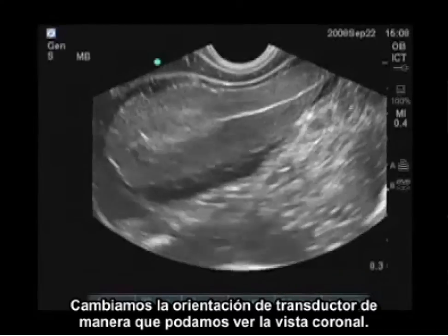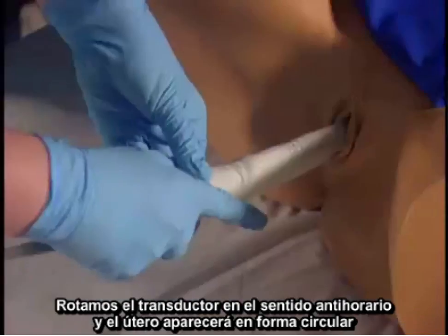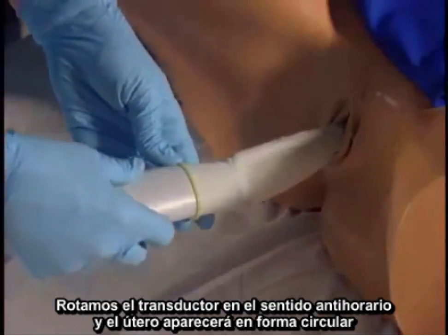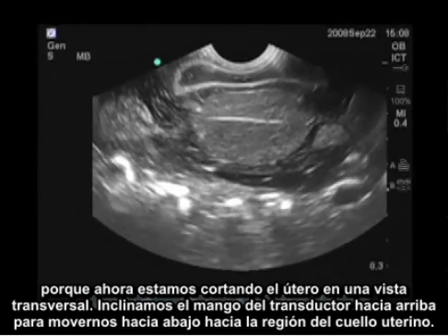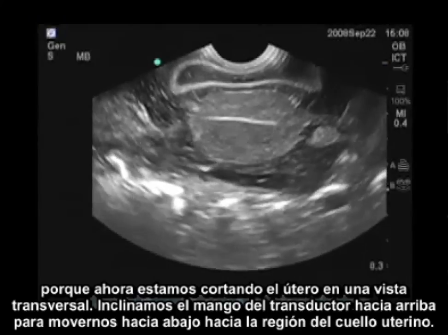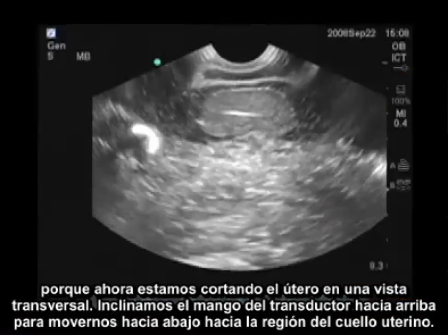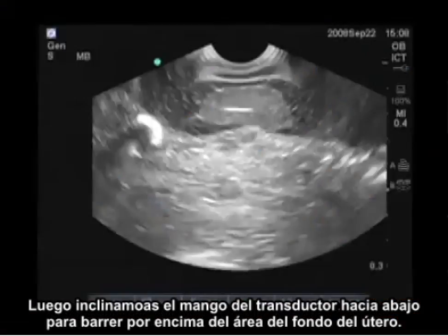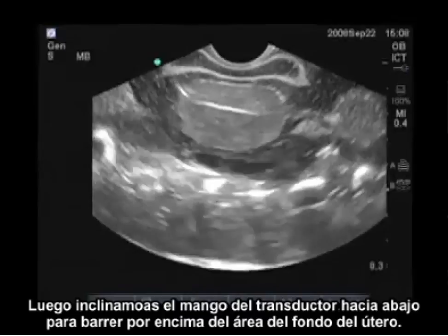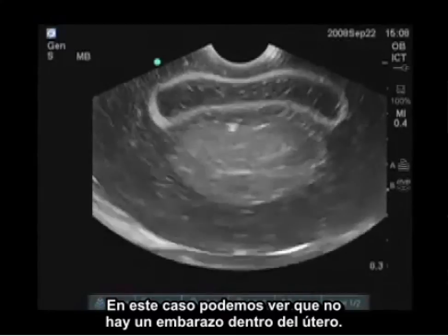Now I'm going to change the orientation of the transducer so I'm in a coronal view. To do that, I'm going to turn the transducer counterclockwise. The uterus will appear circular because I'm cutting a cross-sectional view of it. I tilt the handle of the transducer up to move inferiorly down into the region of the cervix, and then bring the transducer handle down to scan superiorly into the area of the fundus of the uterus. Again, in this case, I can see that there's no pregnancy inside the uterus itself.